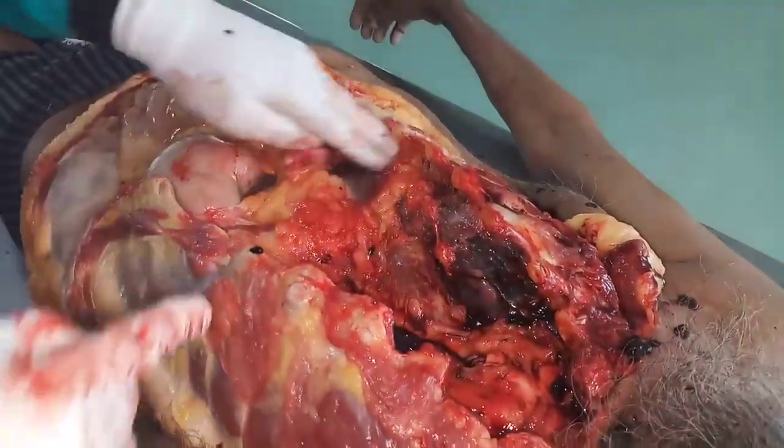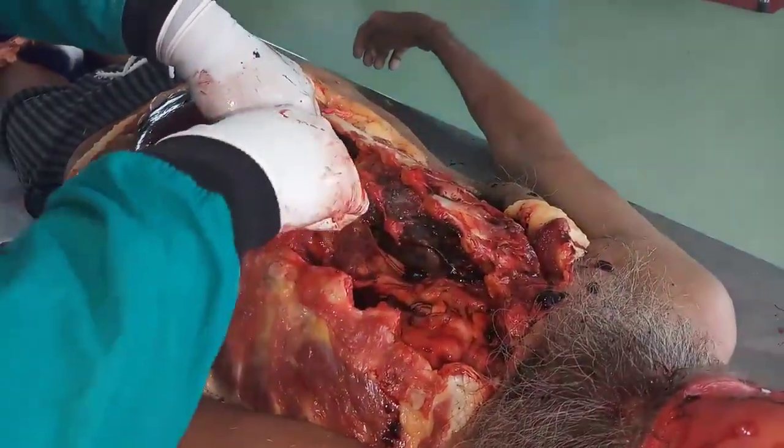I will try to remove the liver first. Let's first remove the liver.